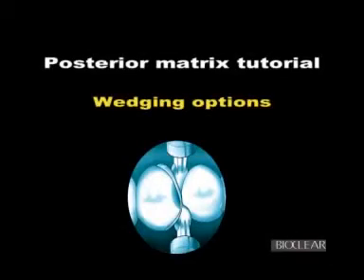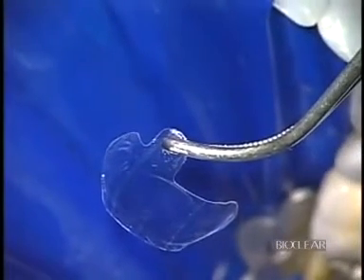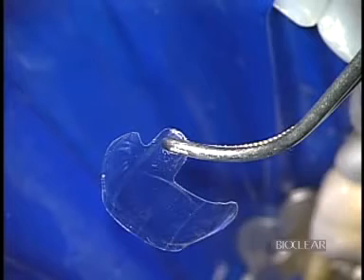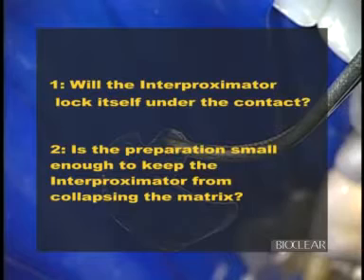For large restorations, deep restorations, or any time that the papilla makes it difficult to place an interproximator, you can always use a wedge to retain the Bioclear matrices. The deciding factors are always, number 1, will the interproximator lock itself under the contact, and number 2, is the preparation small enough to keep the interproximator from collapsing into the matrix.